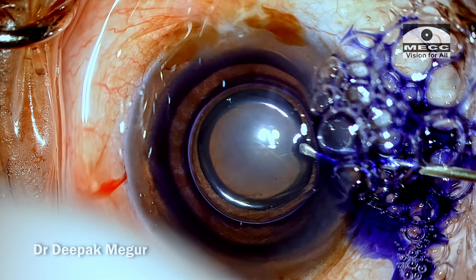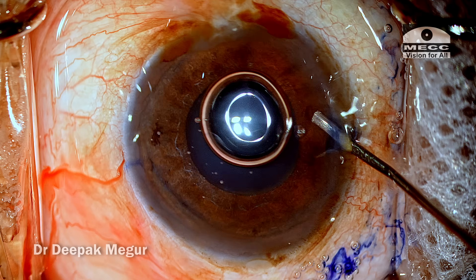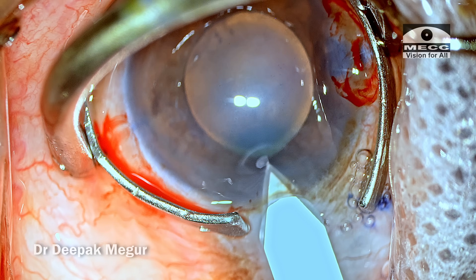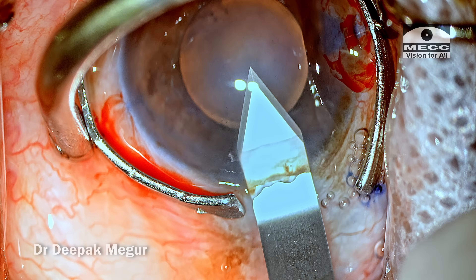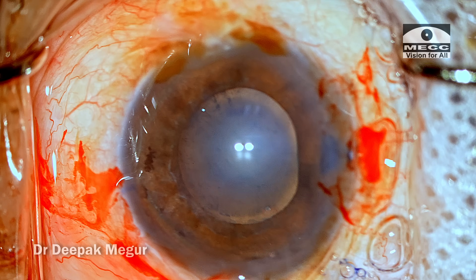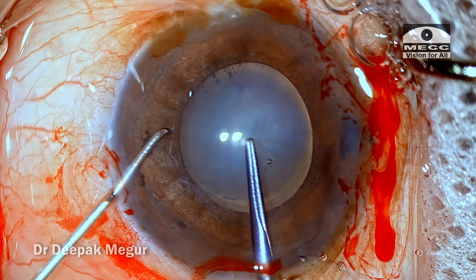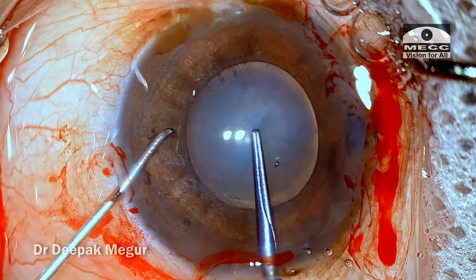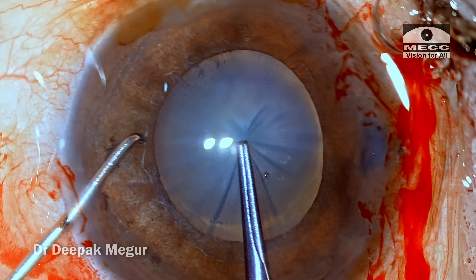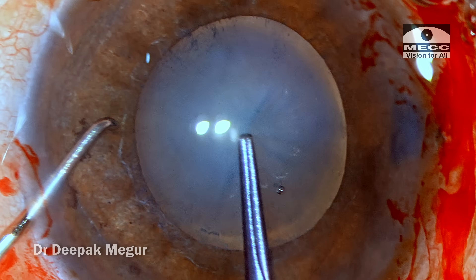Coming to the cataract part of it, the pupil looks to be reasonably all right — it's about 5 mm. Initially I thought I could manage without any dilating device, so I go in, make the incisions, put in OVD to form the chamber. Now is the time to perform the rhexis. The moment I go in and touch this capsule, these radiating folds are seen, which clearly suggest significant anterior zonular weakness, and my repeated attempts fail to puncture the capsule with the forceps tip.